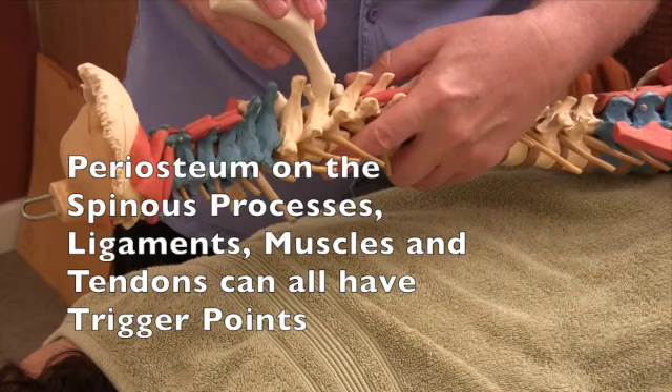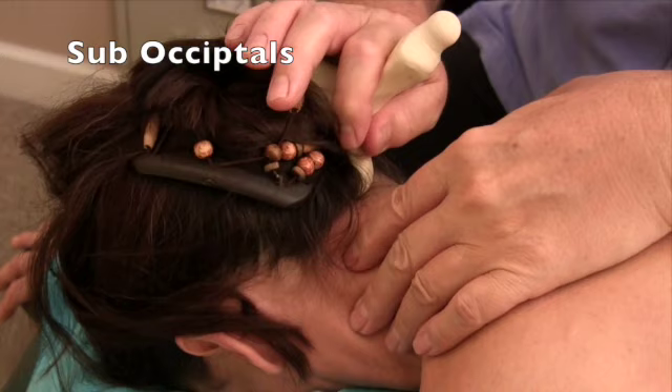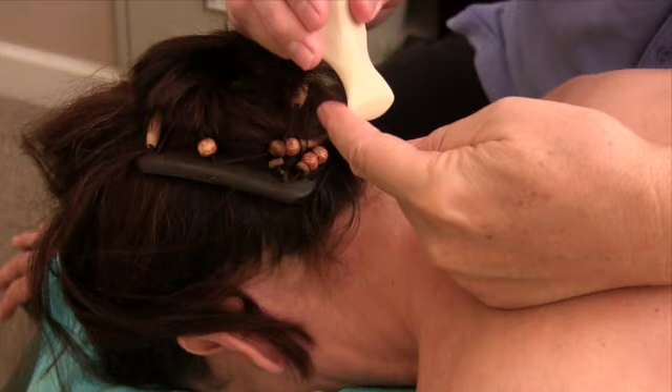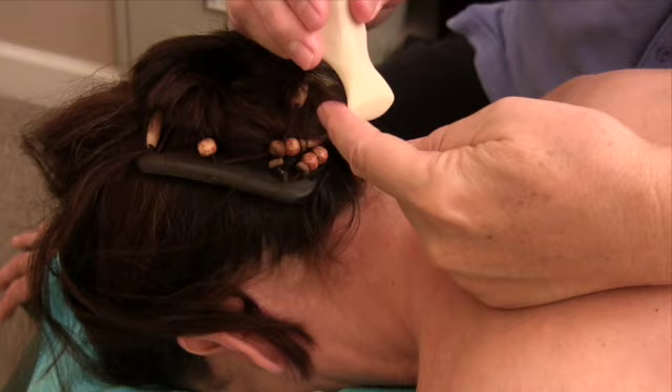As you can see, I can go right in between the spinous processes and get all those little trigger points and little ligaments where they hide. Reach right up into that OA joint, right up into those suboccipitals. Get any scar tissue or any trigger points hiding way up in there that your fingers will never reach. The nice thing about this tool is that when you come across a tight muscle, the tool will just lift up and over that tight muscle.